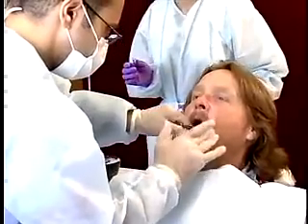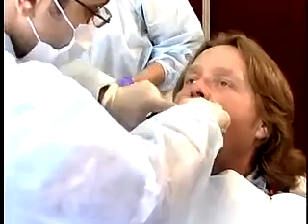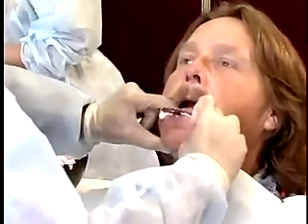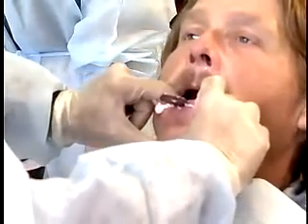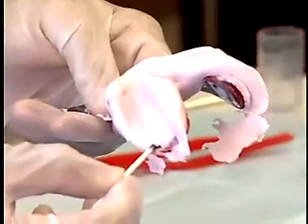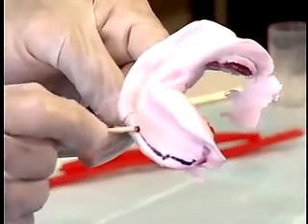The seating pressure is stopped. The border molding is performed so that the impression is not overextended. The tray is held in place until the alginate has completely set. Remove the impression from the mouth. Inspect the impression to determine if it's acceptable.